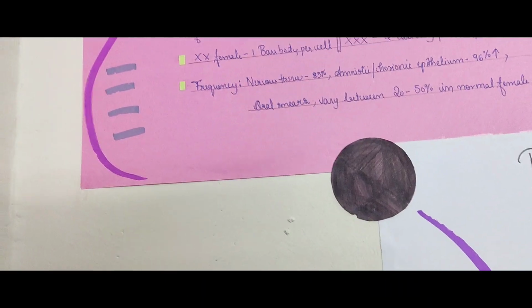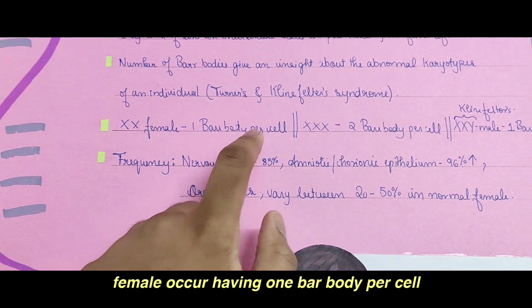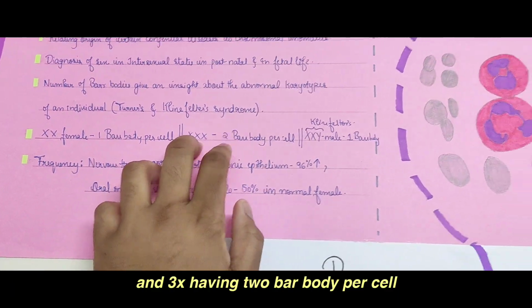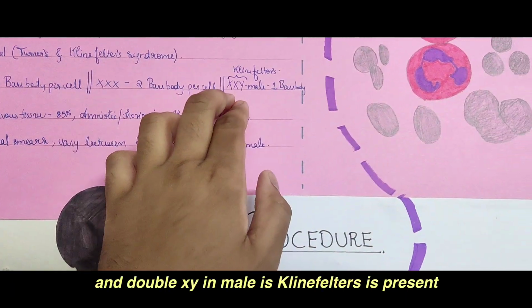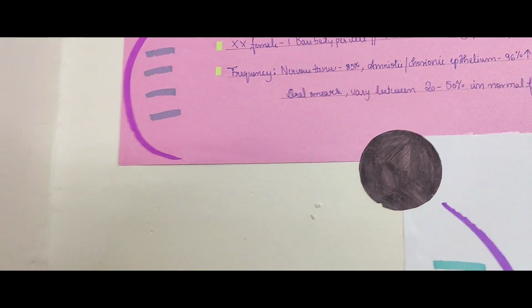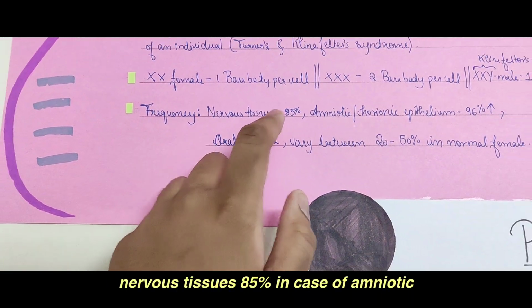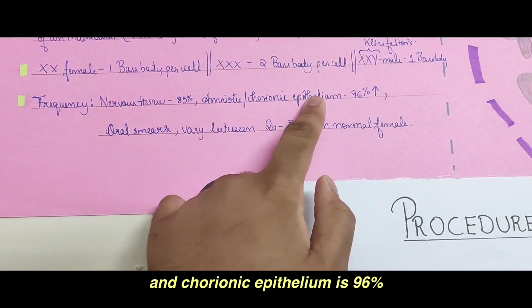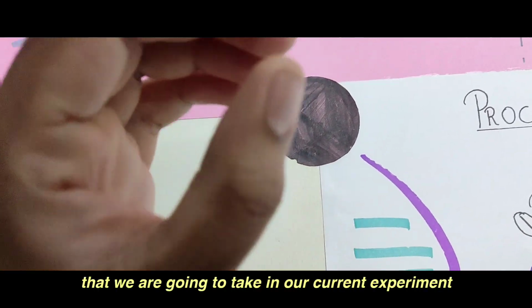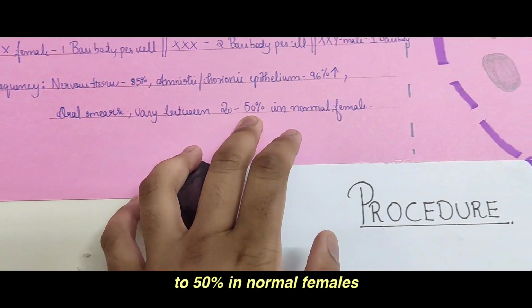Two X females have one Barr body per cell, and three X females have two Barr bodies per cell. In males with double X and Y, Klinefelter syndrome, there is one Barr body per cell. Now the frequency of Barr bodies in nervous tissue is 85%, and in amniotic and chorionic epithelium it is 96% and can increase as well. Oral smears, like the one we are going to take in our current experiment, will vary between 20 and 50% in a normal female.